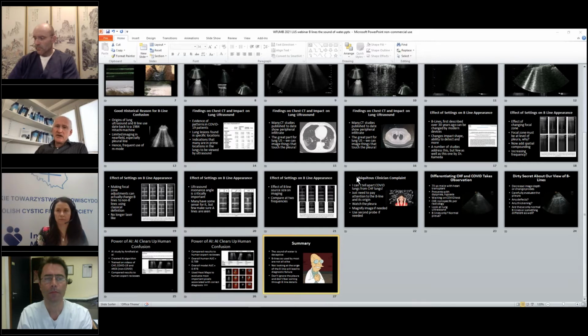In pulmonary embolism, you will find a central supplying artery to a triangular formed subpleural consolidation, and you can see perhaps in the early pulmonary embolism of this small embolic change that the entire subpleural consolidation is not enhancing.